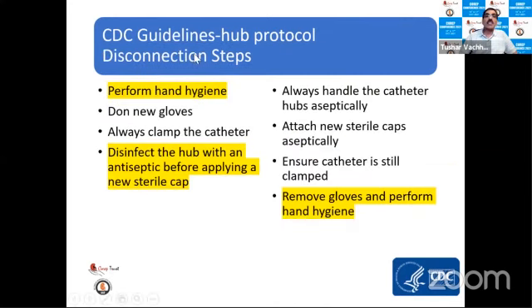Same thing with the disconnection. There needs to be a proper protocol, and the protocol has to be followed by every technician in the dialysis unit every time the catheter is used. The patient has to wear a mask. Now with the pandemic, everybody's wearing a mask, but the patient has to wear a mask. The technician has to wear a mask. Anybody who's close around the bed has to wear a mask.